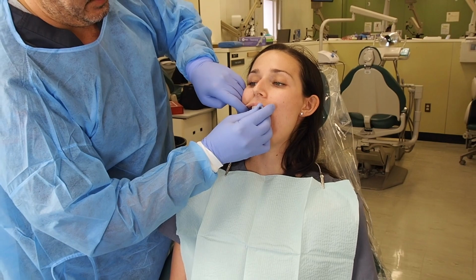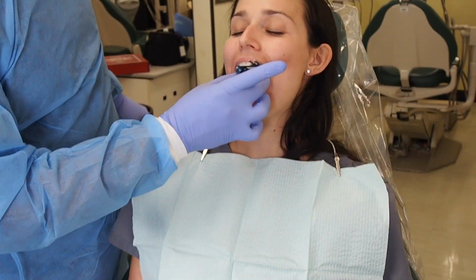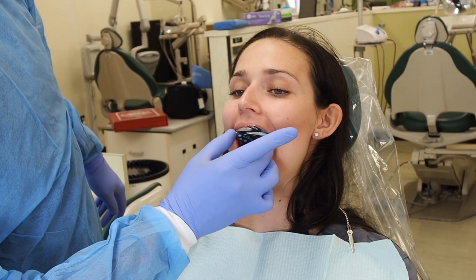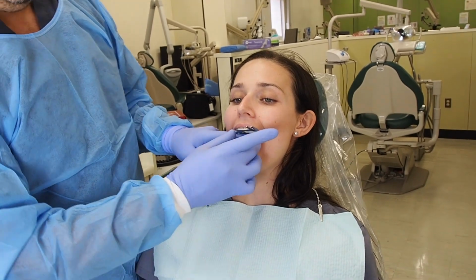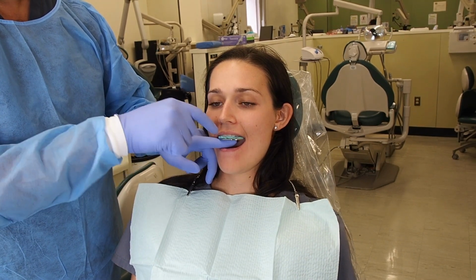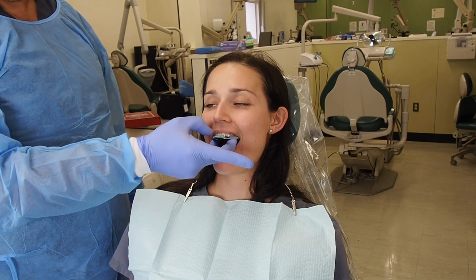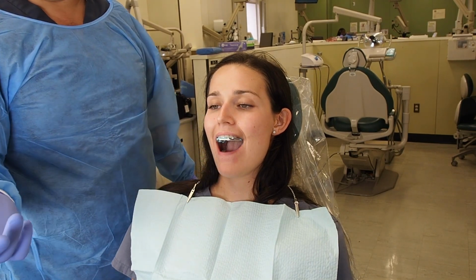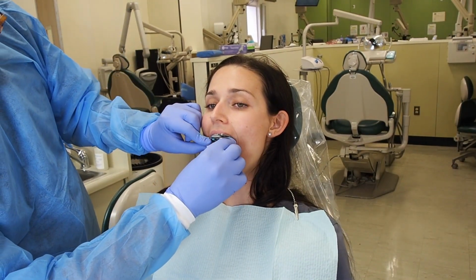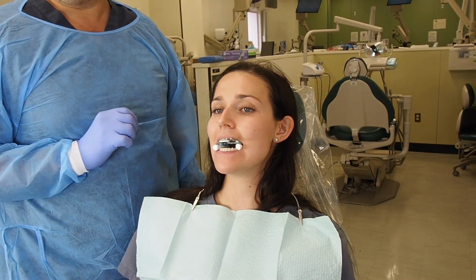I'm gonna make sure that I strike the midline exactly in that section. I'm gonna let it sit there, making sure the midline is right where the midline, can you tilt your head down? The midline of her tooth midline meets that vertical line that I have there. Once this is set, I can leave it there. I can ask my patient to bite on 2 cotton rolls, bite down there, and now I have a very stable fork ready in my patient's mouth.